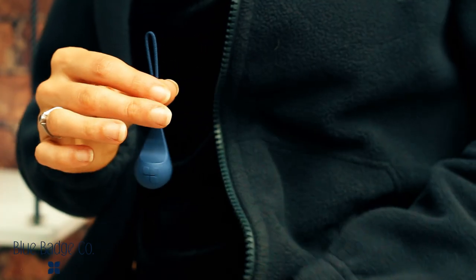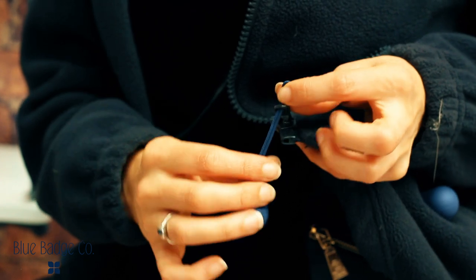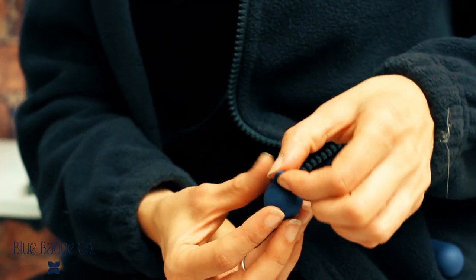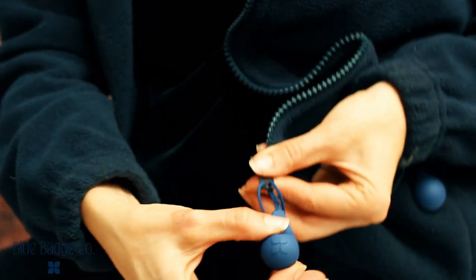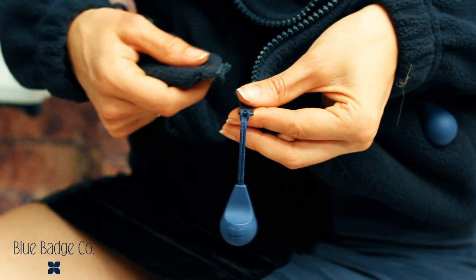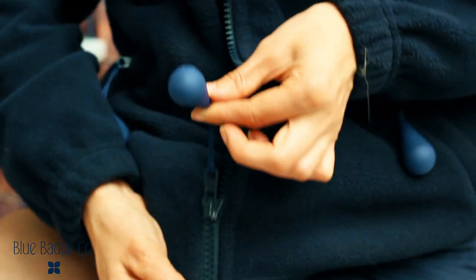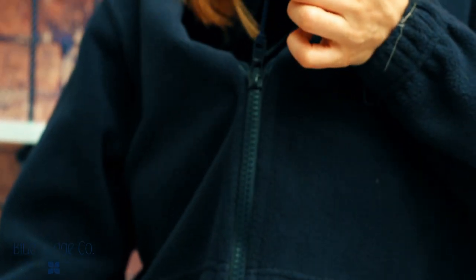You simply take the zip pull and thread it through the end of any zipper. You then take the zip pull and thread it through itself, pulling it tight to create a tight knot. You then put the zip together and simply pull the zip pull. This modern, functional and tactile design will mean you never struggle with a fiddly zip again.